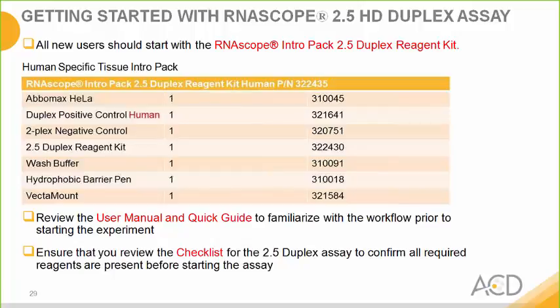Please do review the user manual and the quick guide to familiarize yourself with the workflow prior to starting the experiment, and ensure that you have the checklist for this assay to confirm that you have all of the required reagents before starting.